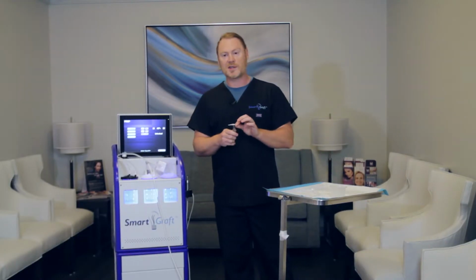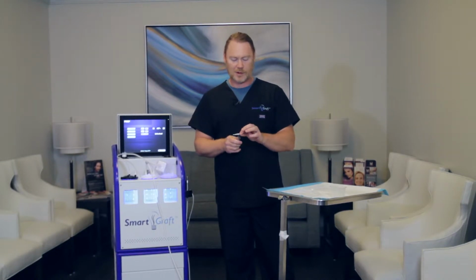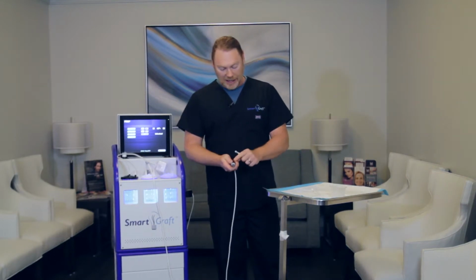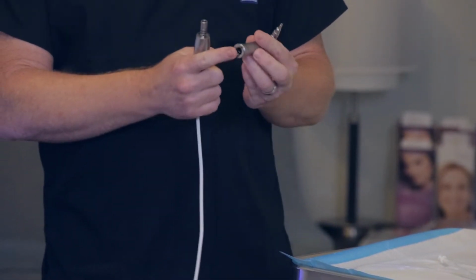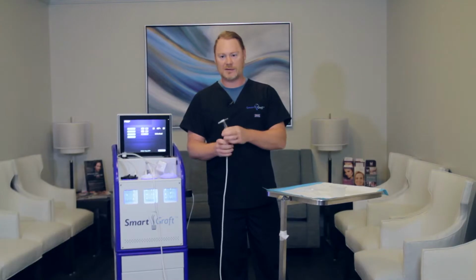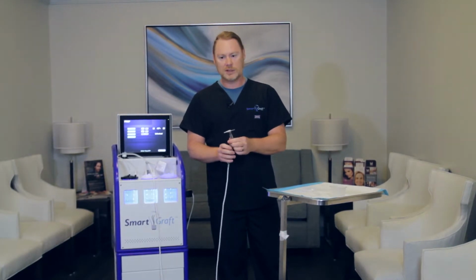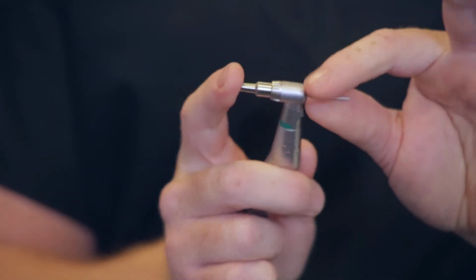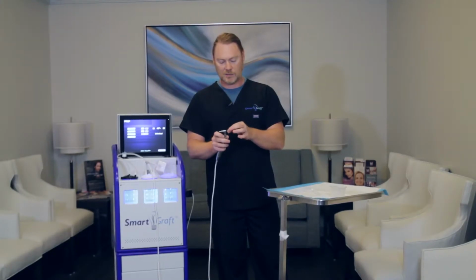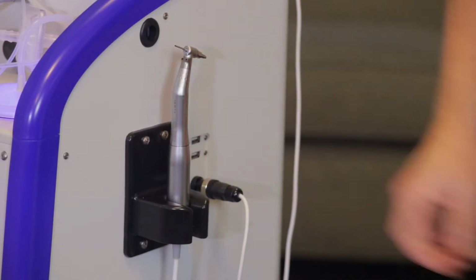If you don't have this in securely, you'll lose a little bit of suction, and you'll know that it's that part of the device. To put this onto the motor itself, it has a little tiny insert here with a protrusion. You want to make sure they line up, and it just snaps on like that. To remove, you just pull it off. Same thing to get it back on. Now to remove the punch, you will have to use this back cap to actually pull it out, but you do not need to depress that button while putting it in. This just sets down on its nice little handle here.